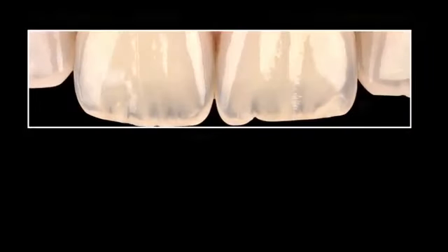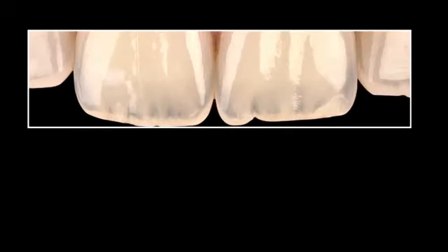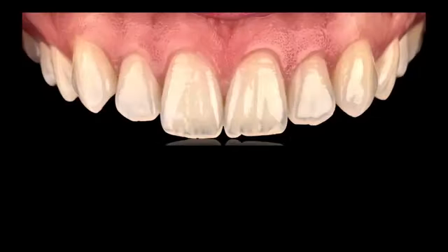Here you have another example, and another one. So this is not even the original photo. This is the cropped photo. And if you look, I cropped the cropped photo, and I get also this level of sharpness. So just dry the gums before.